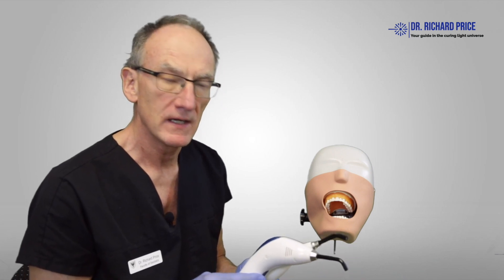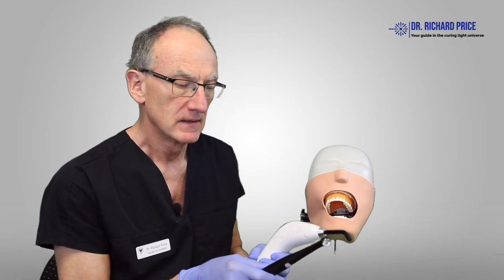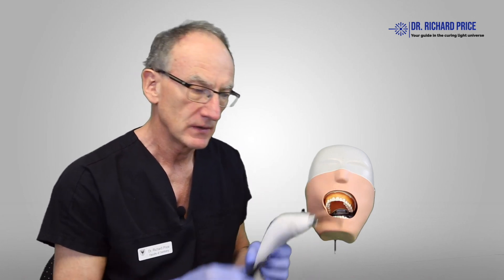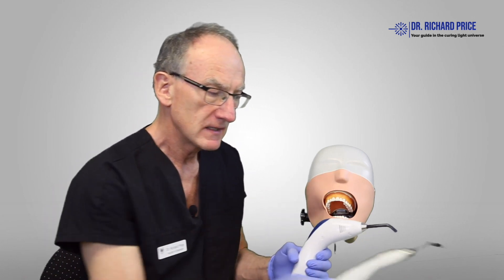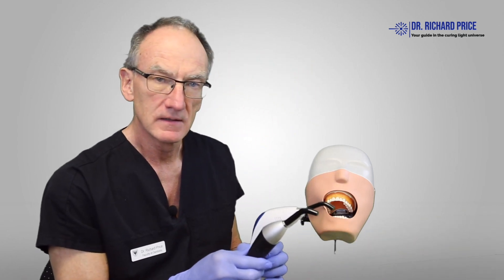Some curing lights may perform really well on the laboratory bench, but then when you try to put them in the mouth they don't work that well. Here we can see two different designs of lights, and you can kind of guess that this one has probably got better access than this one. But there are many different designs of curing lights like this, and like this, and like this — and you know, kind of which one is the best?